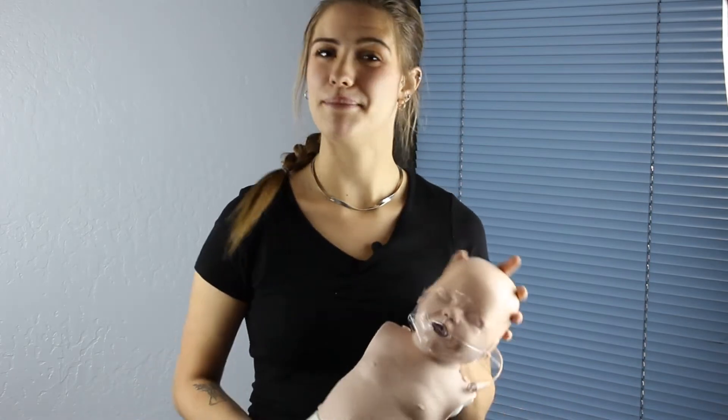Welcome to CPR Savers Product Review. My name is Sydney and today I'll be showing you how to use the Infant Ultralight Mannequin by Preston.